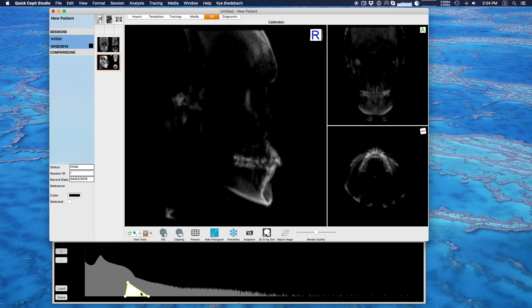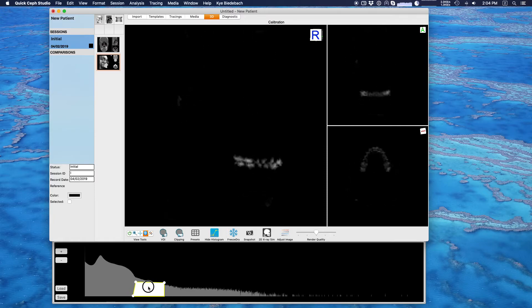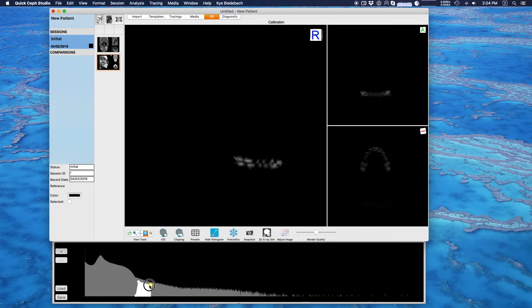We're getting to the most dense tissues — this patient has some braces and some fillings. So the rest of that area on the far right is just braces and fillings.